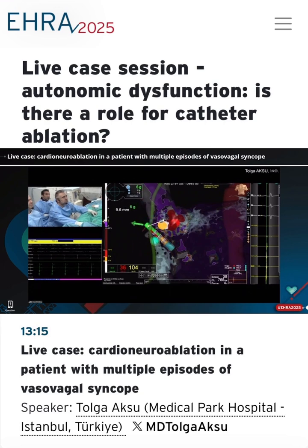What I think is really useful with this approach with anatomical mapping, did you try to see the sinus node artery with the CT at this point? Just thinking, actually, if you need to go bilateral or something. Yeah, in my previous case on CT, yes, I already saw the localization of the sinoatrial node artery, but we couldn't merge it. I couldn't understand why. In the previous case, I checked. Can you add the arteries on CT? Maybe let me check it again.